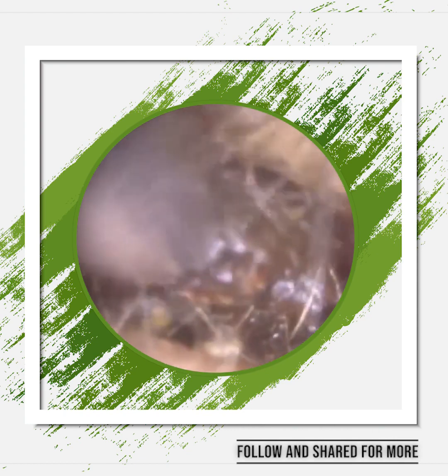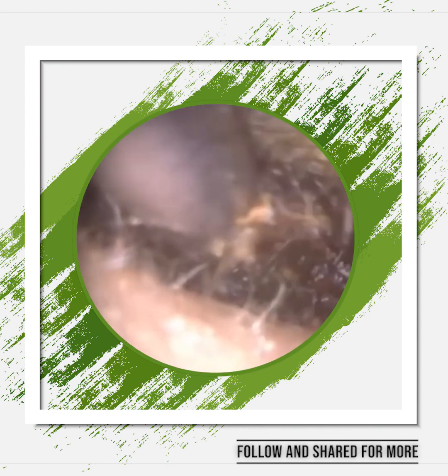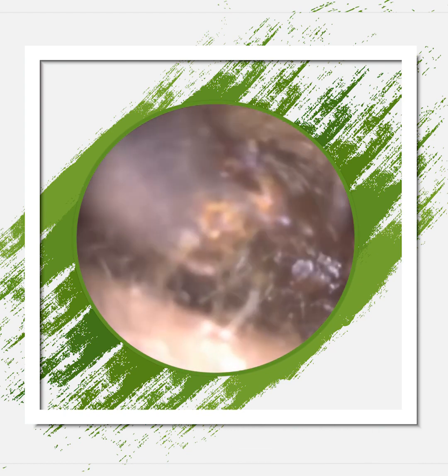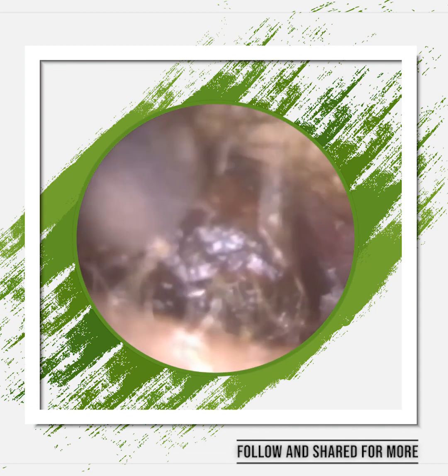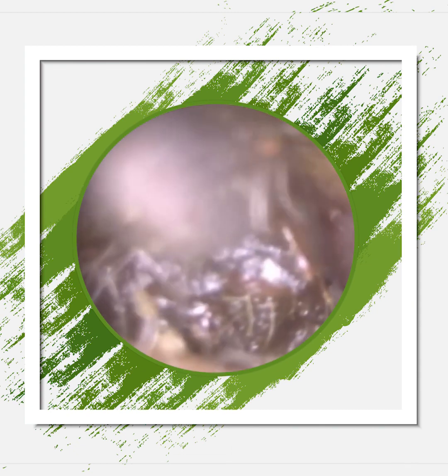I was reluctant to put any drops in just to help, because the patient had been using drops quite a lot. Not sure how well they've been using the drops because the wax is still relatively quite dry. There were some parts of the wax, more lateral, so near the entrance, that was a bit more wet. That had soaked and absorbed the drops.